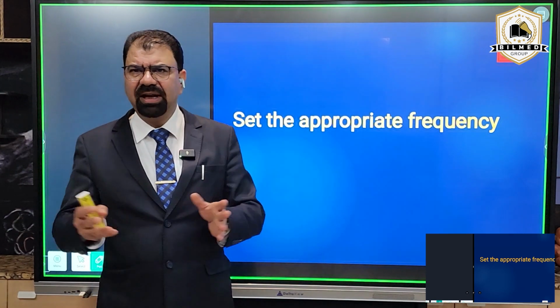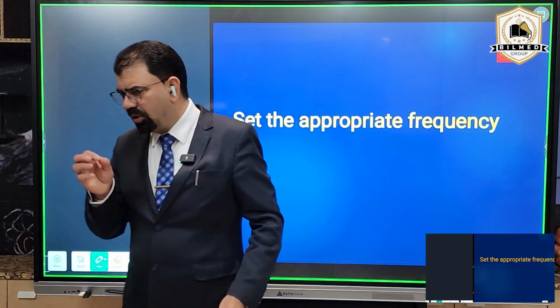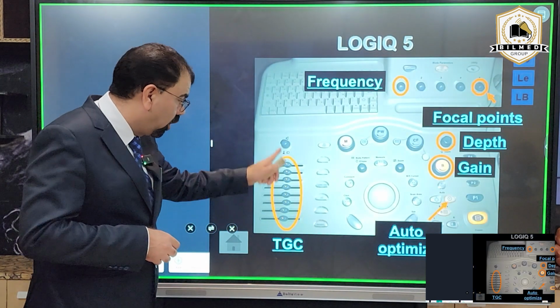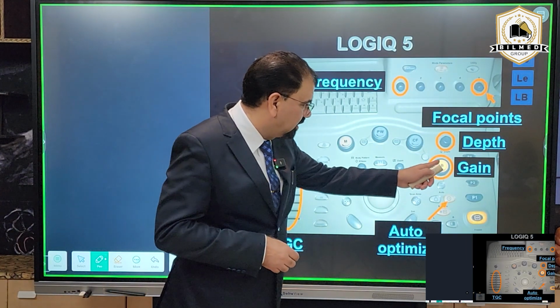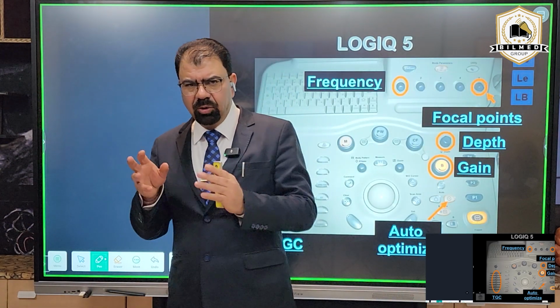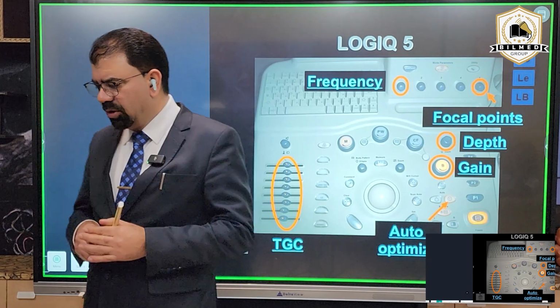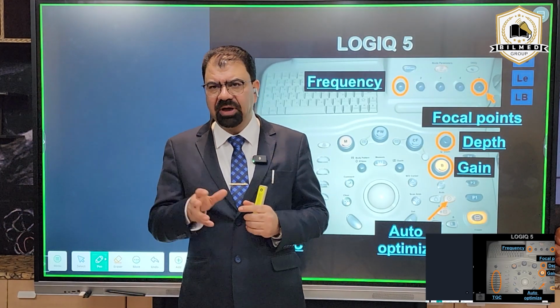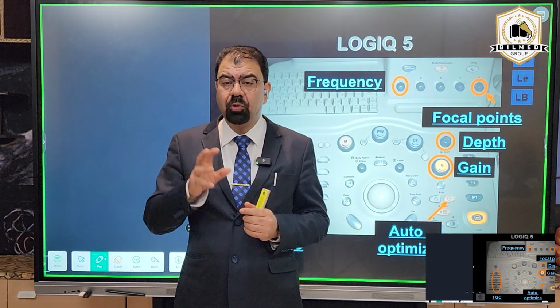These things will take time. The basic important point is that I am not here to teach you each and every knob, or what the focal point is over there. I just want to make you understand how important the knowledge of knobs is.